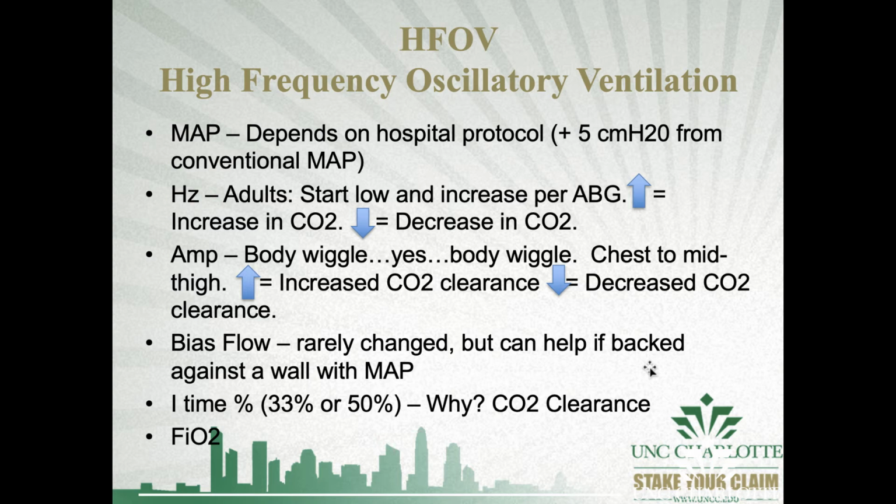Now our hertz or our frequency in adults, we generally start lower than we would in pediatrics, okay? So when I say start low, and this is just a protocol I've always worked off of as long as I've been a respiratory therapist, we're going to start at 6 hertz, okay?